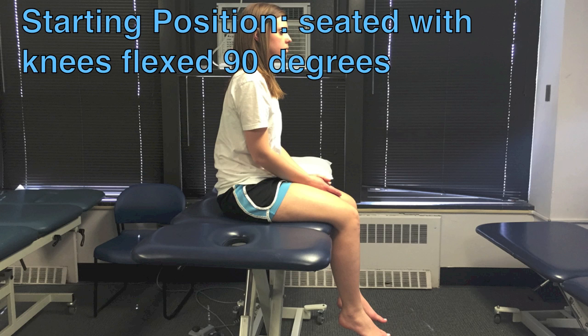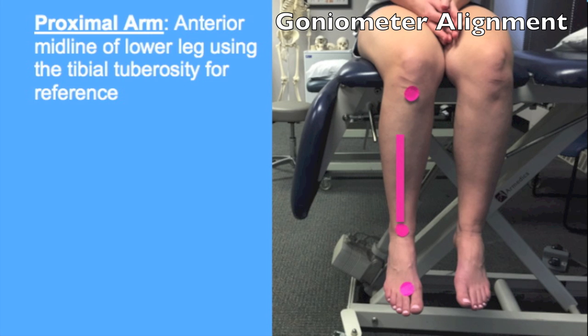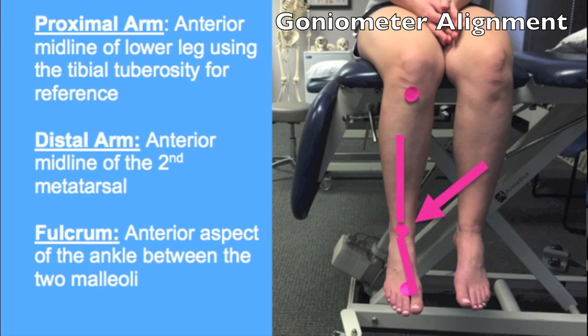Patient starts seated with knees flexed to 90 degrees, with hips in 0 degrees of rotation and 0 degrees of abduction or adduction. The following goniometer alignment applies to both tarsal inversion and eversion. The proximal arm should follow the anterior midline of the lower leg using the tibial tuberosity for reference. The distal arm should follow the anterior midline of the second metatarsal, and the fulcrum is the anterior aspect of the ankle between the two malleoli.